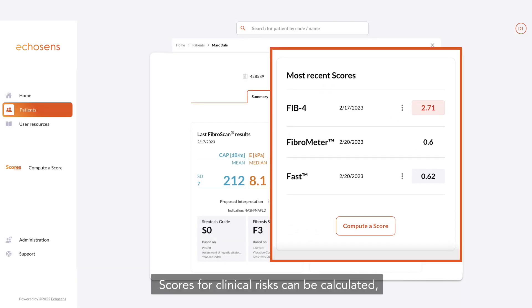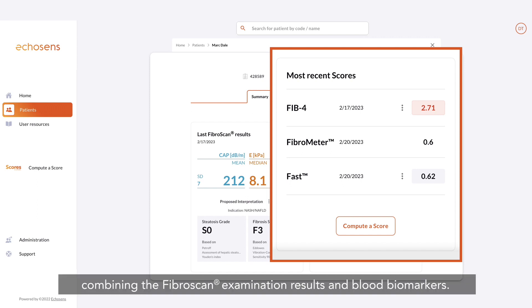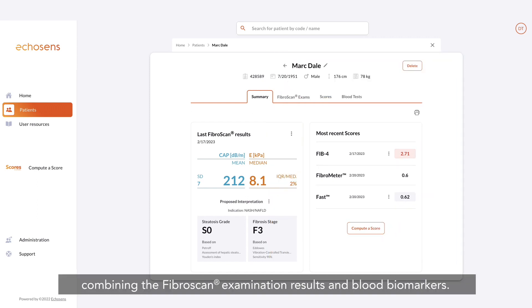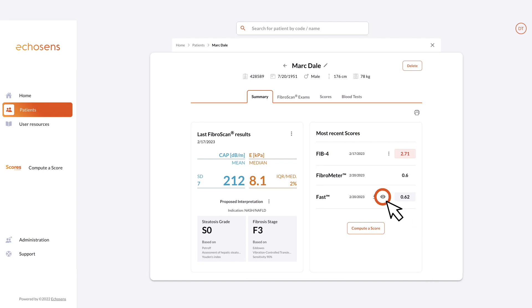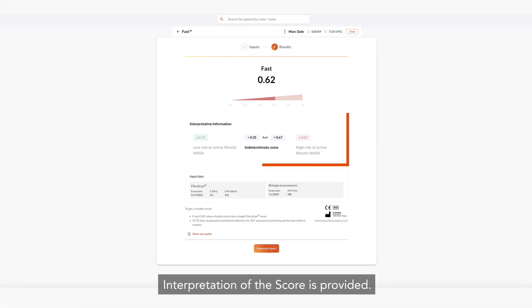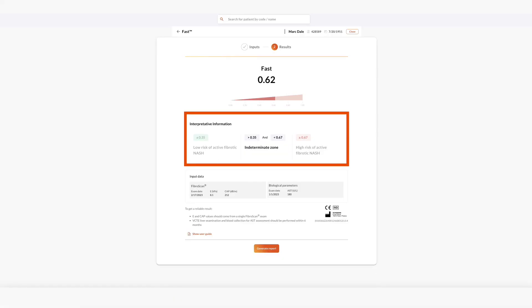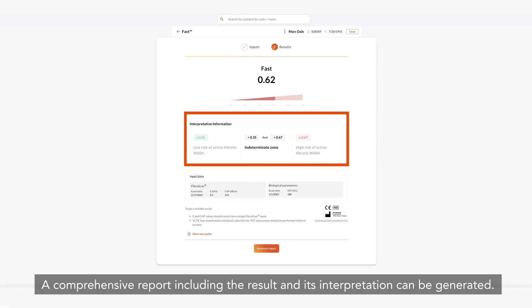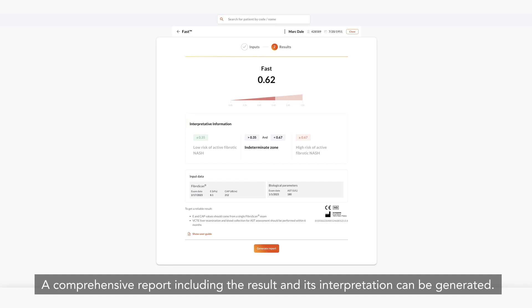Scores for clinical risks can be calculated by combining the FibroScan examination results and blood biomarkers. An interpretation of the score is provided. A comprehensive report, including the result and its interpretation, can be generated.